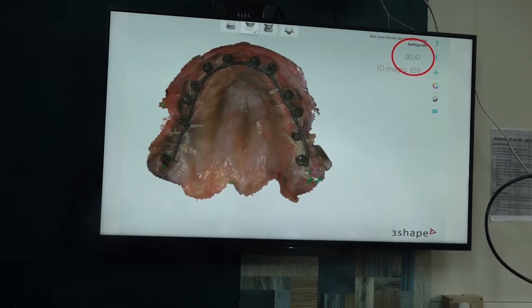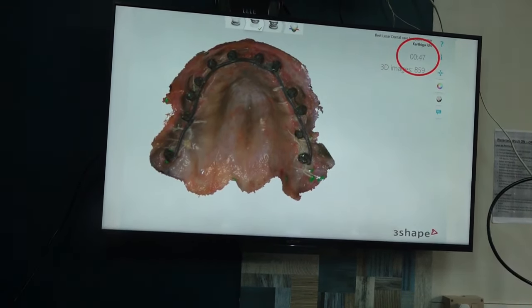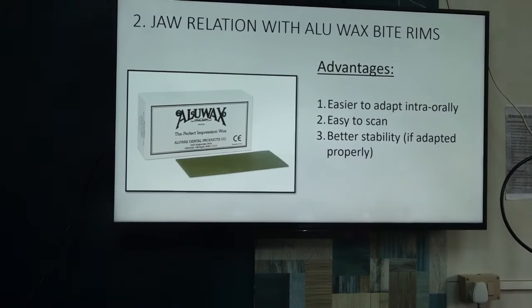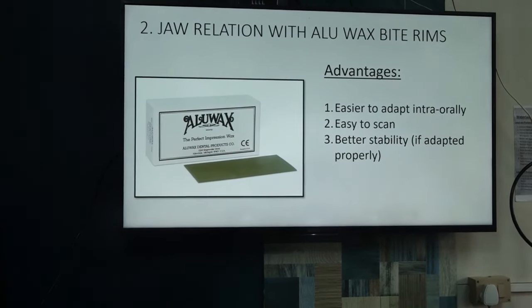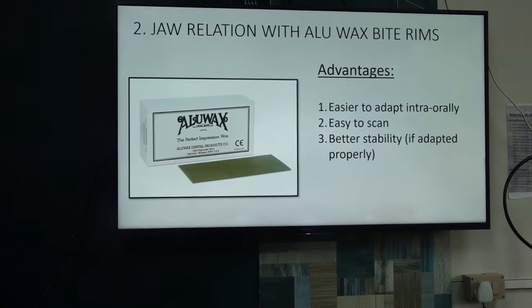If for a full mouth implant it is like that, for a dental scan definitely it is the same, actually it should be less. So what is the first workflow? What is the first step? Scan upper arch, lower arch.